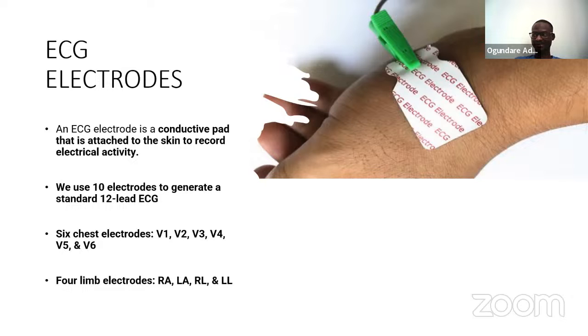So in case wherever you are listening from, that's not the color code you have there, just take it and look at it. It will always be written on it. So you have the RA, LA, RL, and LL. So that gives us 10 electrodes.